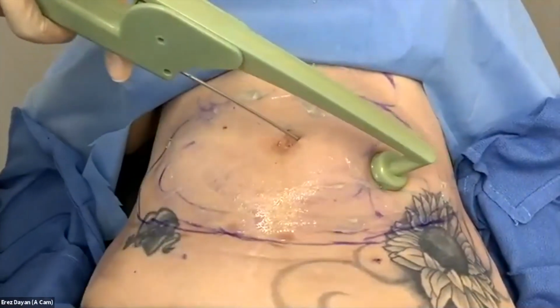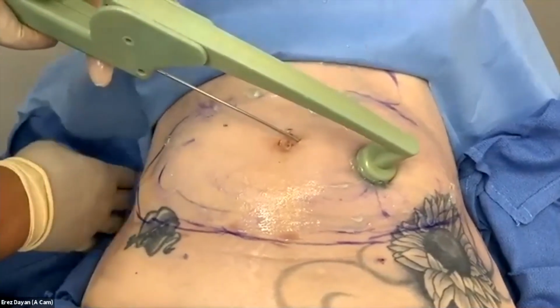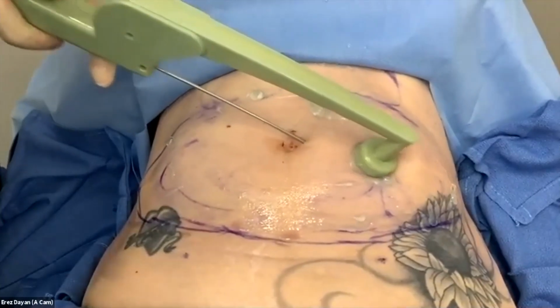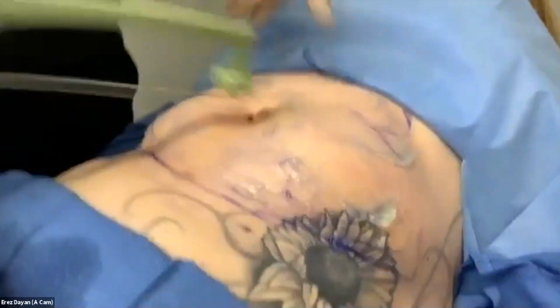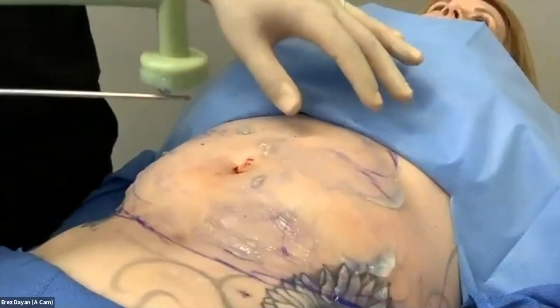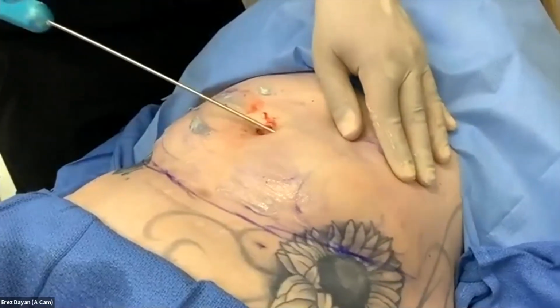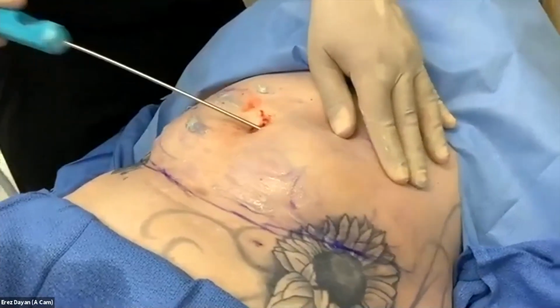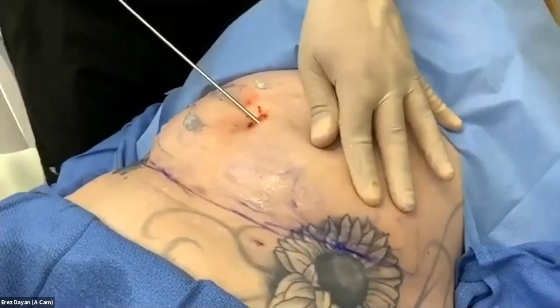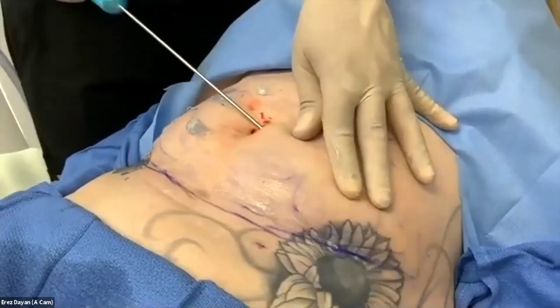So moving slow. You feeling okay? Good. You feeling that medication kicking in? Not really. After 5 kids, you need 5 Valiums. Okay, so that's external there. What I'm going to do is treat this hemiabdomen, and then I'm going to lipo it a little bit. Sometimes they're just sensitive, like in this case, in certain areas. And it makes it harder for sure because you want to thoroughly treat the whole abdomen and optimize. But you obviously know they will tell you when they feel pain.